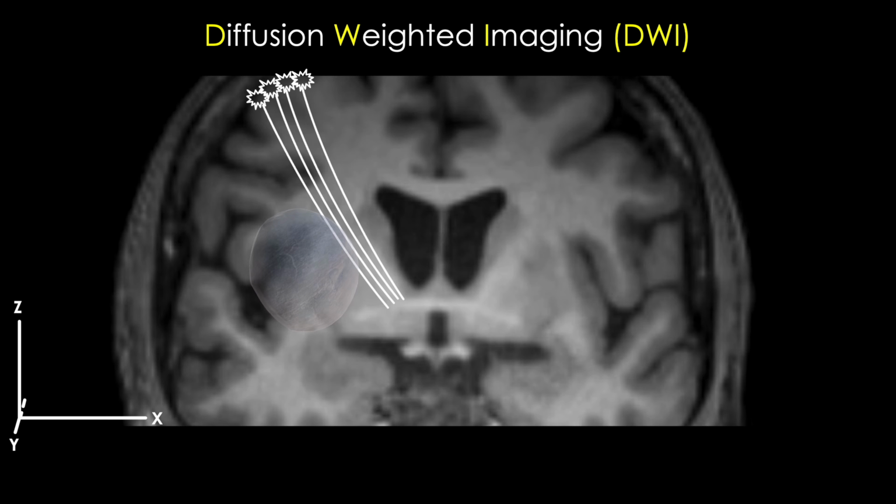What if there's a brain tumor right next to these tracts, and the surgeon wants to get as much of the tumor resected as possible without entering the tracts, because, as you can imagine, some pretty devastating things can happen if you start severing the cables that these very important signals are carried on. Is there a way we can figure out where these tracts are and the direction they're traveling via how our water molecules diffuse along these tracts?